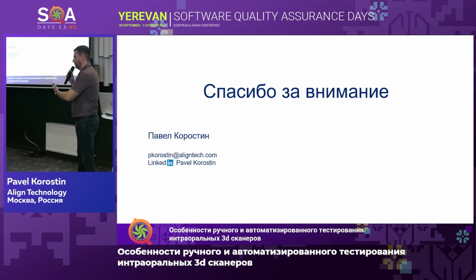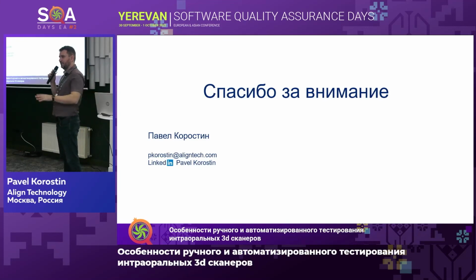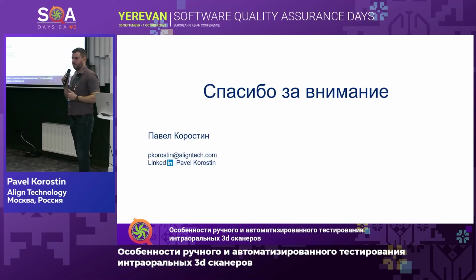Yes, thank you for your question. Of course, my team is just a first frontier. We also have the so-called V&V teams, validation and verification teams. All of them have medical education. They do acceptance tests. Additionally, we have doctors we have close relations with, like beta testers. They get a beta app and they provide us with feedback.